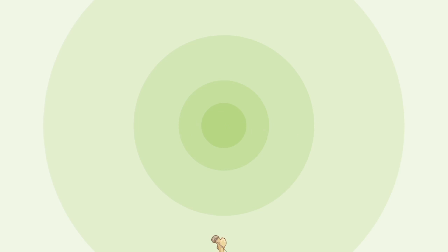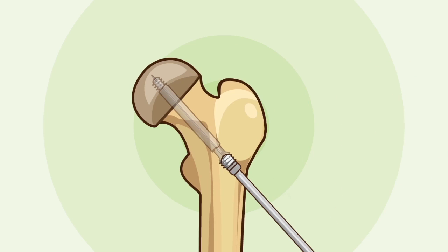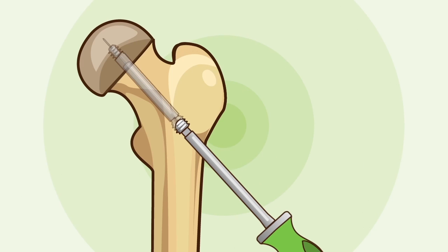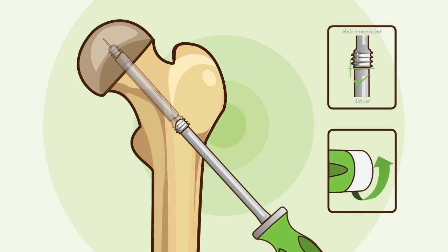Cap removal: Use the cap driver to remove the cap. Male component removal: Engage the driver into the male component by turning the locking knob clockwise. Remove the male component via a counterclockwise rotation of the handle.